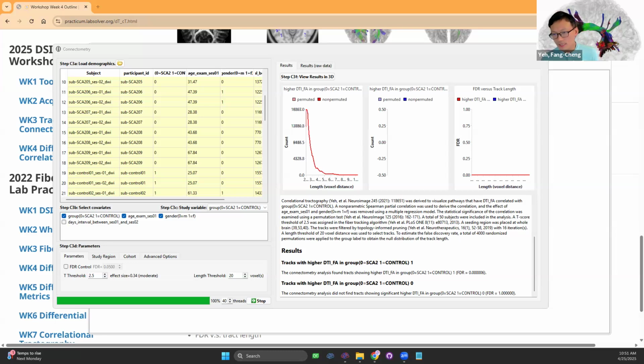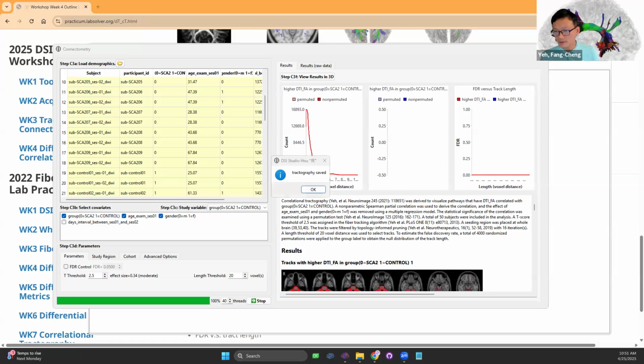So by definition of the experiment, it will be longitudinal. Cross-sectional means you need to compare two cohorts, subject and healthy control. But depending on the experiment setting, you can make it cross-sectional. If you compare post-operative patient data with the control, then it's cross-sectional.